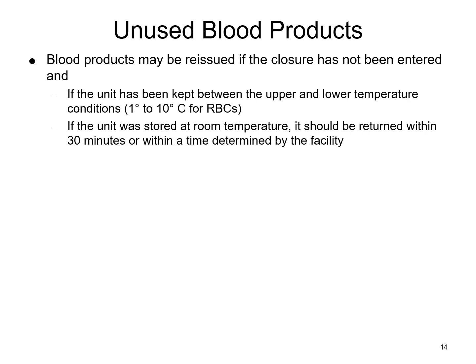Let's say, for example, you send up blood for a trauma, so it's usually going to be released in a cooler that has ice packs in it. There are some kind of temperature indicators on those units to make sure that temperature is maintained. In situations like that, if it's not used, so they call for a trauma, you would take the cooler up, it's not as severe, there's no serious bleed, they don't need those units, or they can wait for compatible blood, then you would get that cooler back and put those units back into inventory, making notations that the temperature was maintained.